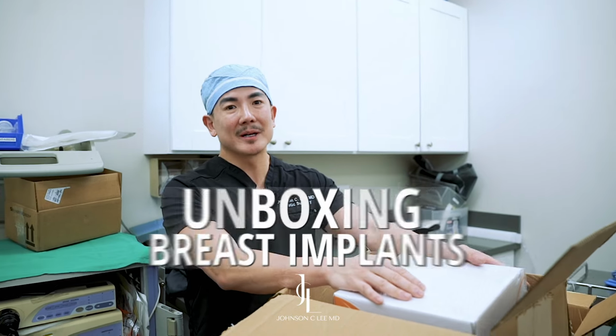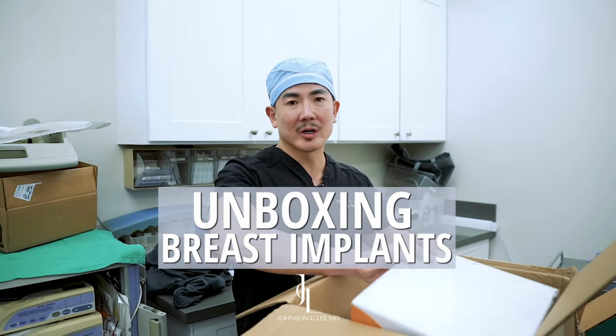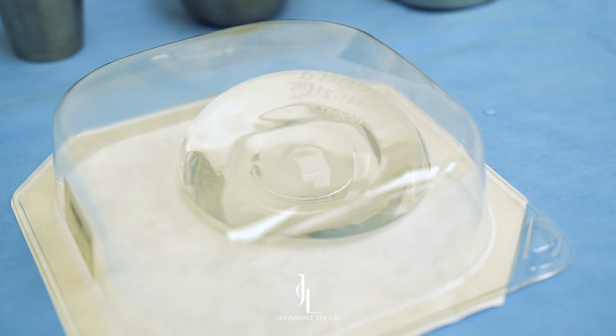So whenever I'm ordering implants, the most important thing is to make sure that I order the right size implants for my patient. So usually I'll order a couple extras just in case I need them, but they come in very quickly. Within about 48 hours, I get the implants ready.